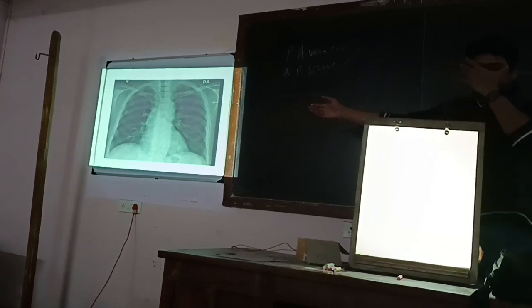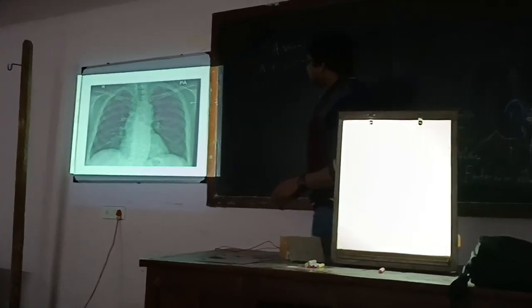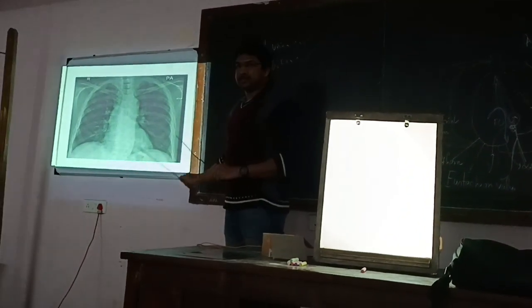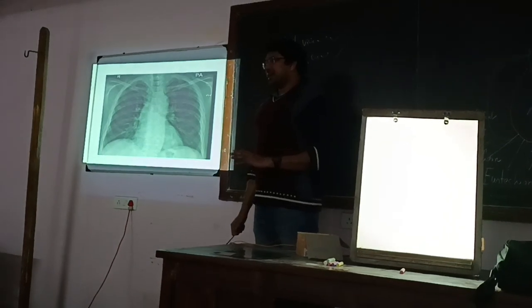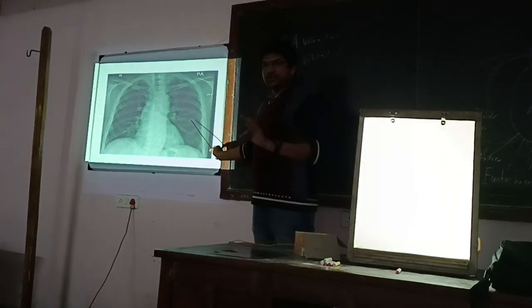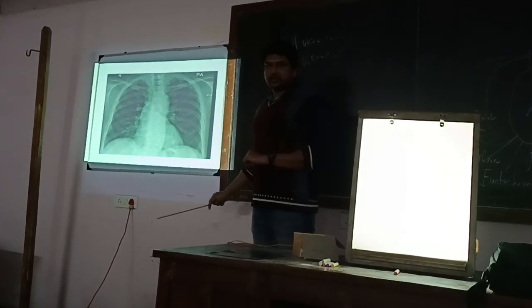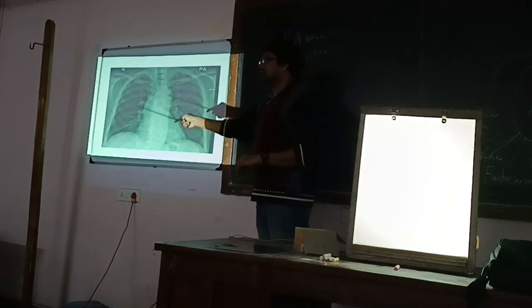So you can see that. This is the postero-anterior view of the thorax over here. If somebody gives you the X-ray plate and asks you to describe this X-ray, you have to say 3 points. One is the view, one is the region, and whether it is a contrast X-ray or not. Contrast X-ray or plain X-ray: plain X-ray means no dye will be used.